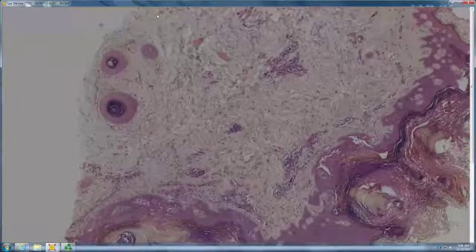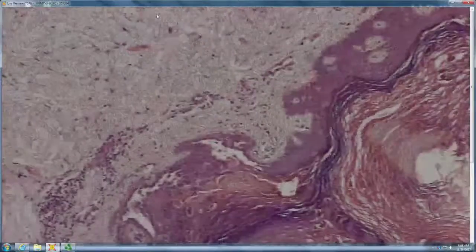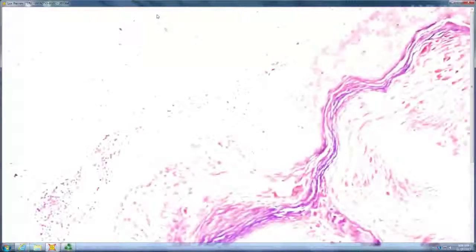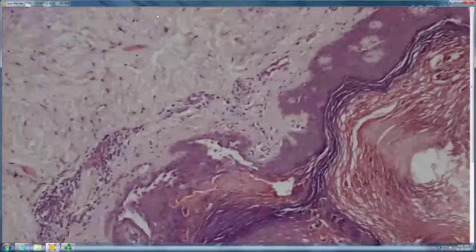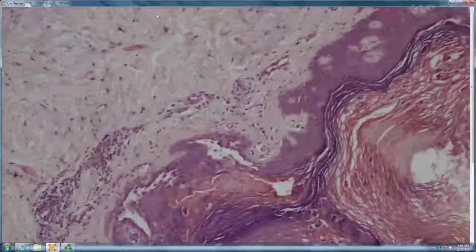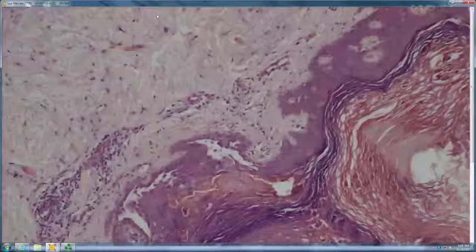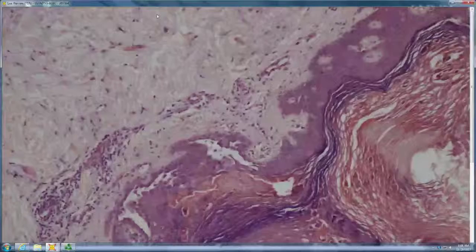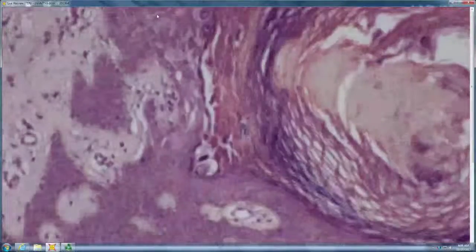This is a pretty endophytic lesion, I feel like there. There's some dyskeratosis as well and acantholysis. So they go up into the corneum. And some of the granules almost look like EHK a little bit too, I'm not sure. But it does look like maybe a warty dyskeratoma or something along those lines.